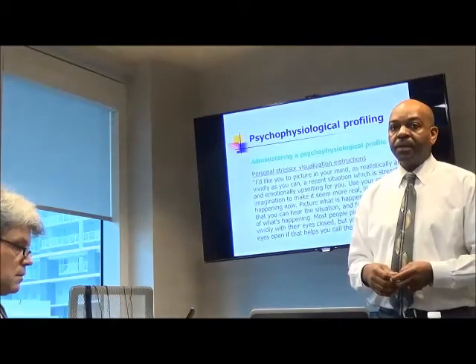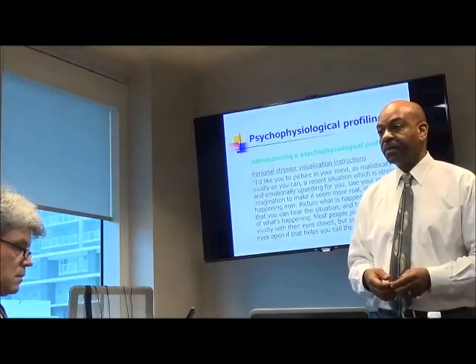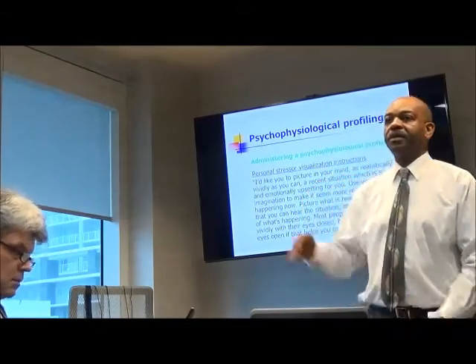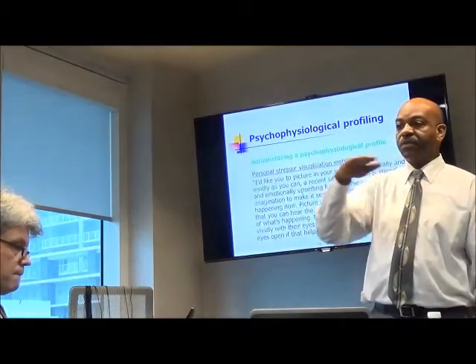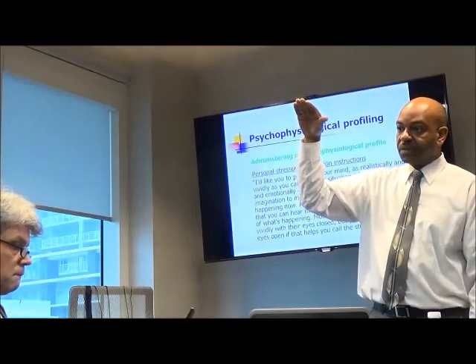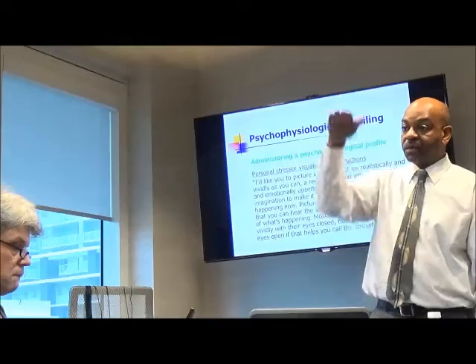Right. Well, yeah, we want to see what happens. But it would be normal that they would get a bit worse during the session. Sure. We're not expecting that it's just going to be flat during the stressor. So let's say, for instance, if there's some increase in muscle tension during the stressor, when they finish talking about it, we want to see, does it come back down or does it stay up?